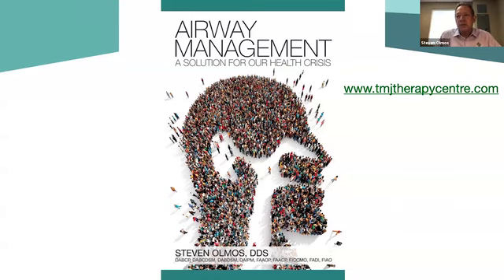I published the phonetic technique, which is a three-dimensional technique of positioning and giving tonus to the airway without protruding it. Because if you have a cant and you protrude, you're likely to have a disc displacement issue in those situations. So I do not use that technique. We published just at the end of last year a head-to-head of the phonetic technique, or sibilant phoneme registration, versus the George gauge technique, which is what I think this person's asking about. And in our study, we took 40 patients using each technique in different offices and found that the phonetic technique that doesn't protrude the jaw was equally as efficacious without protrusion. And also, we had fewer titrations, because you already have an ideal relationship, so there's no need to titrate it.